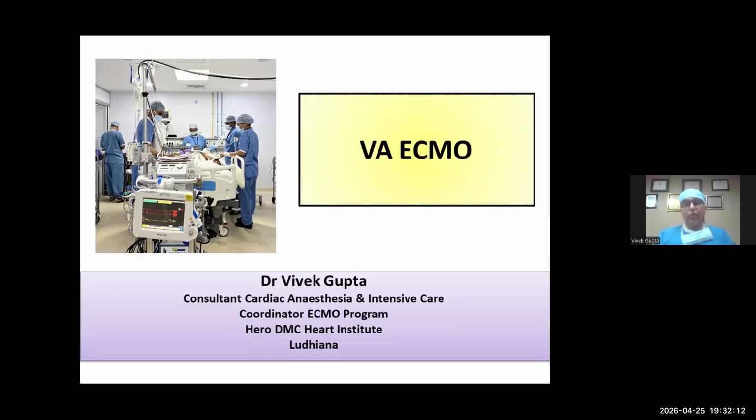So in the recent past, almost in the last 2 decades, ECMO has gained significant popularity. This was after the very popular CESAR trial, and there was the H1N1 pandemic, and we all know that after the COVID pandemic, probably everyone knows about it. And definitely for ARDS, it was VV ECMO.